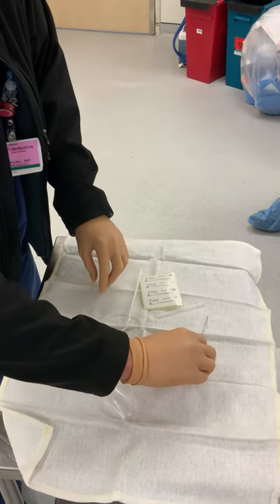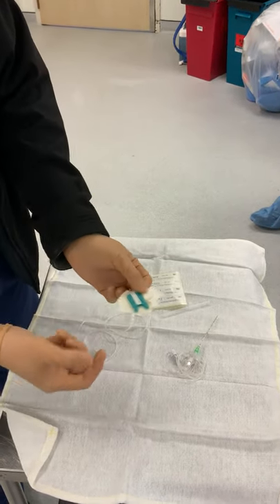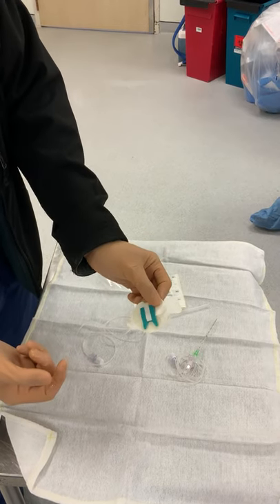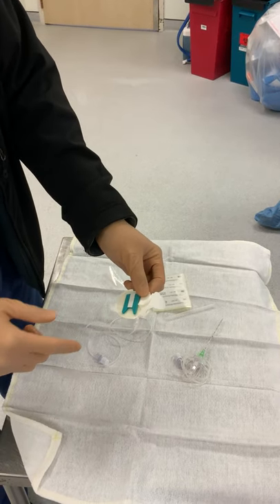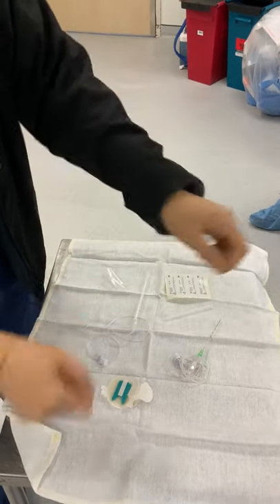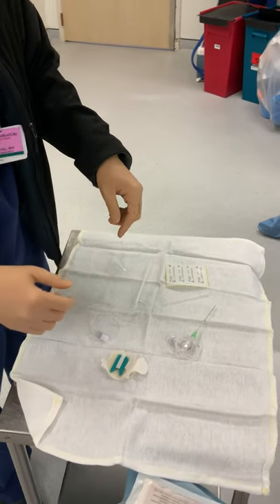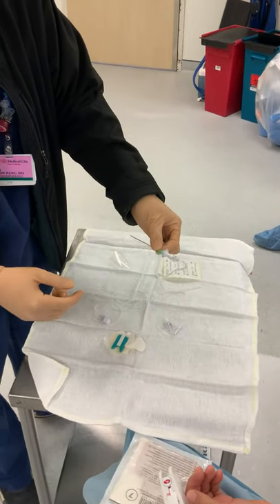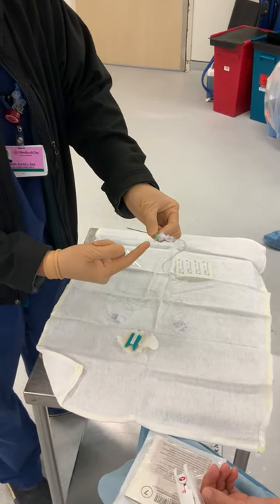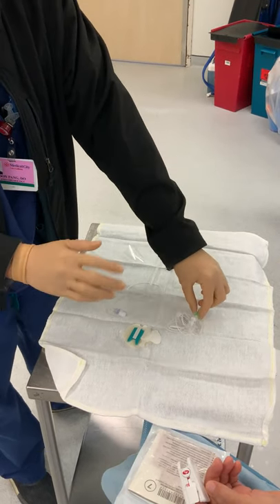There's one more thing here, which is a special piece of adhesive. We use this to affix the nerve catheter onto the patient's skin. Now, some people may like to just use some steri strips, put a tegaderm over it and call it a day. Others might be more serious about it and actually suture the nerve catheter into the skin like an arterial line or a central line. I'm not going to be doing that today though.